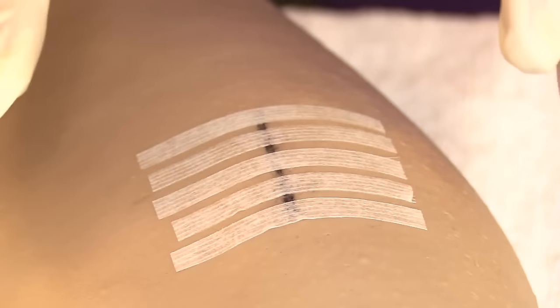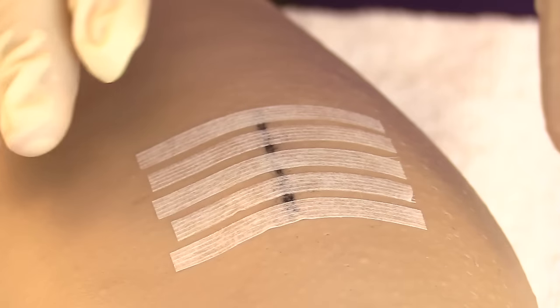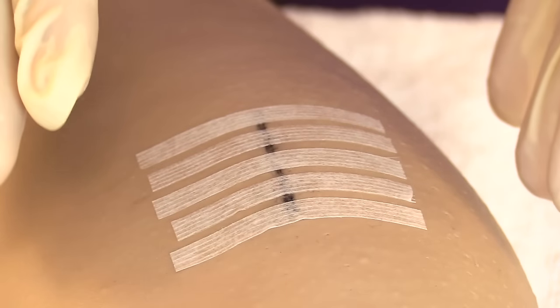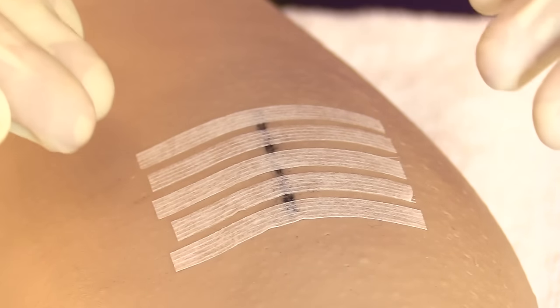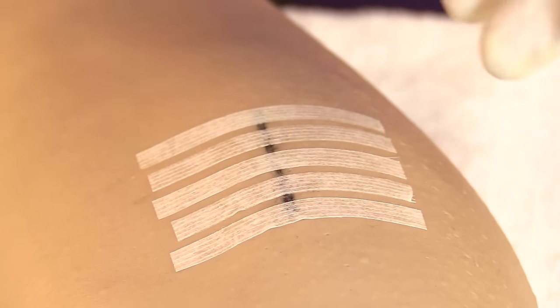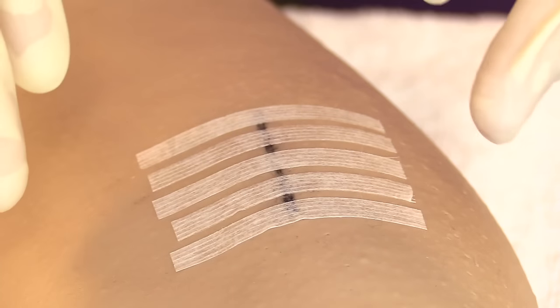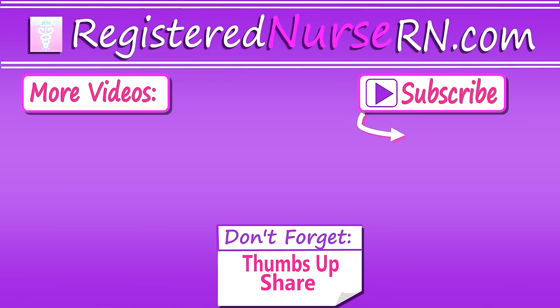After applying the steri-strips, assess whether the site is in an area prone to friction — such as rubbing against clothing — or excessive moisture. If so, apply a dressing and give the patient supplies to change it regularly. Educate the patient about signs and symptoms of infection, and let them know steri-strips typically fall off within 10 days and should be allowed to fall off on their own. Finally, doff your gloves, perform hand hygiene, and document.